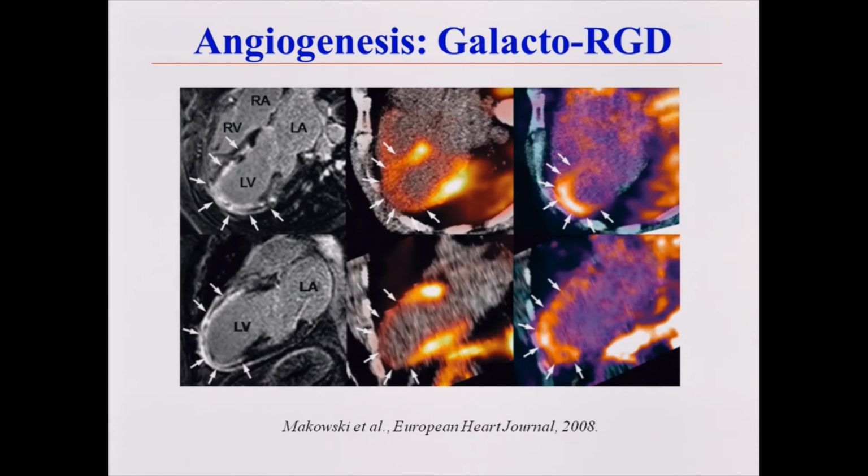And I think we see some interesting data, and I think this is ongoing work. One of the challenges of RGD is obviously it's an integrin imaging, very widely expressed target. It's on immune cells. It's on virtually any moving cell. A very widely expressed target, but this was certainly a very intriguing preliminary work.